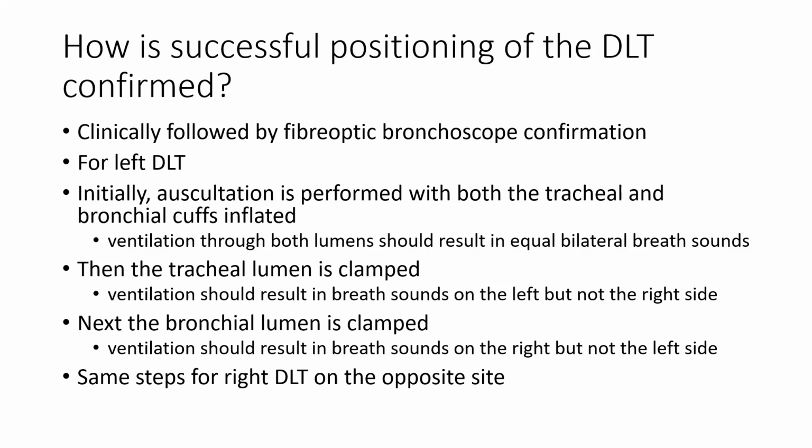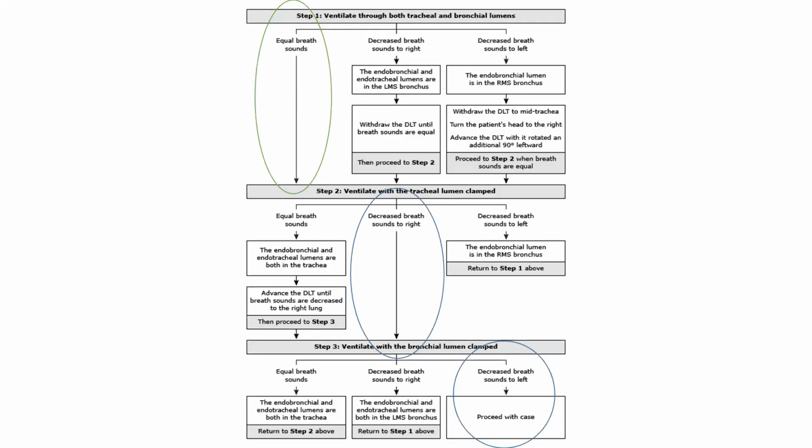So we should repeat the same steps for a right double lumen tube, but on the opposite side. Okay. This flow chart is showing how we confirm the placement of a double lumen tube clinically.